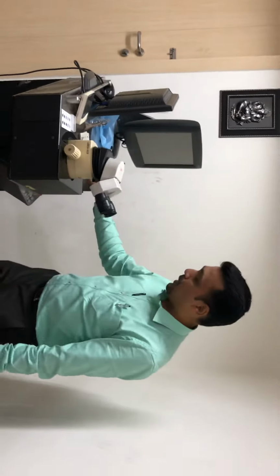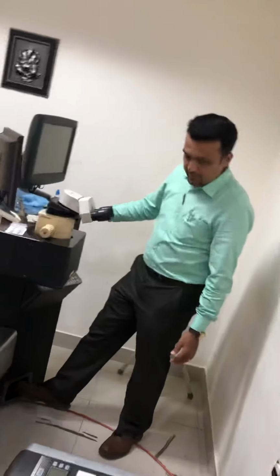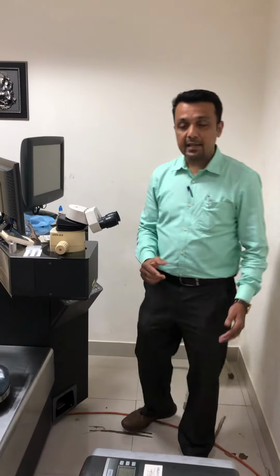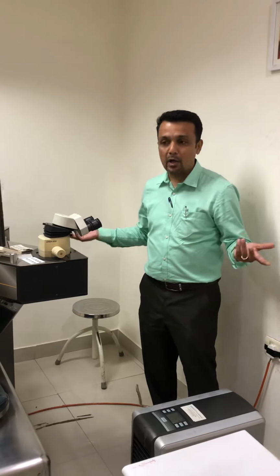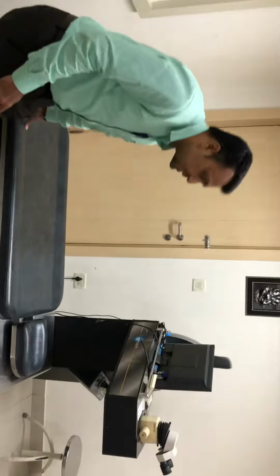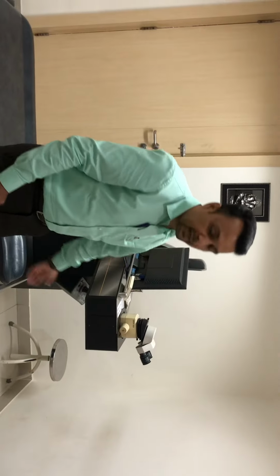Once we enter the parameters and do the centration of the machine, this is the foot pedal, which we press so that the laser starts firing, and within 5 minutes the entire procedure is over and the patient's -4 power is gone and he goes out completely without glasses. So now this is the area where the patient lies down and the table goes up and the patient's eyes are focused under the microscope.